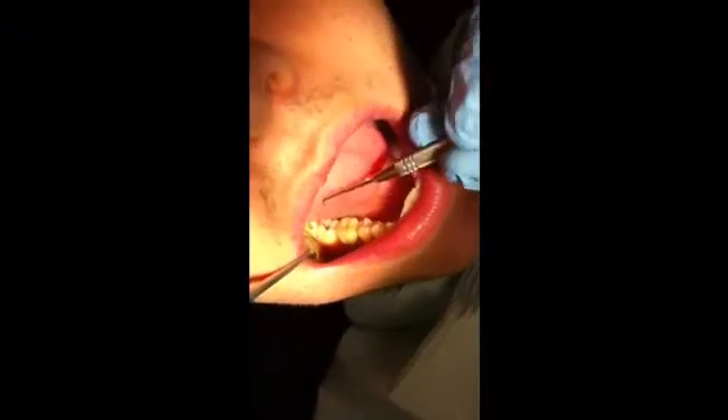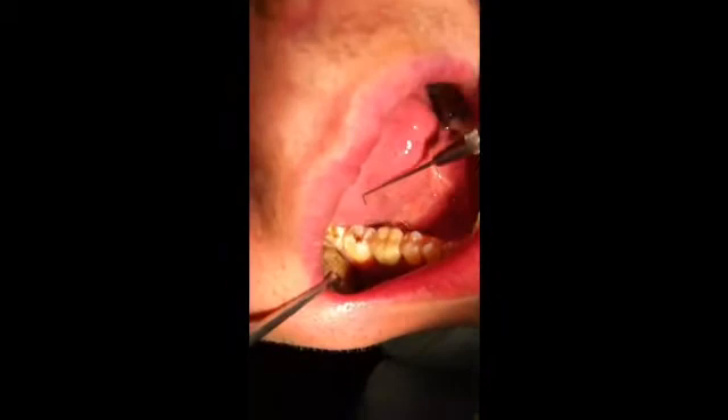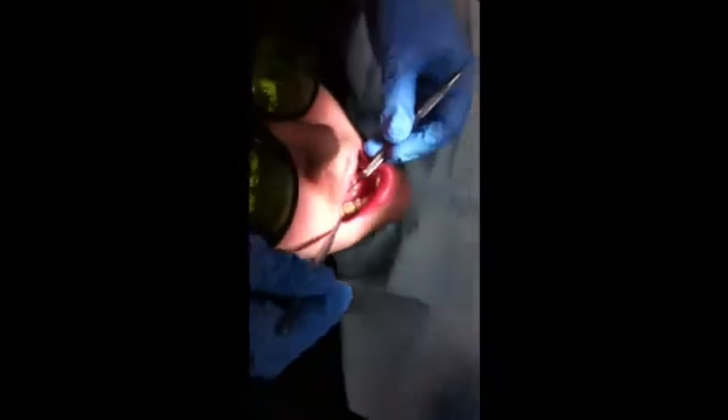I don't even know what the prep looks like after. Wait a minute — hold on, it went crazy. It went to air and now it cracked. Hit the circle at the bottom. Go into the crown and then hit this. We're good. That was me when I hit it. Alright, we ready? Yes. That looks better.